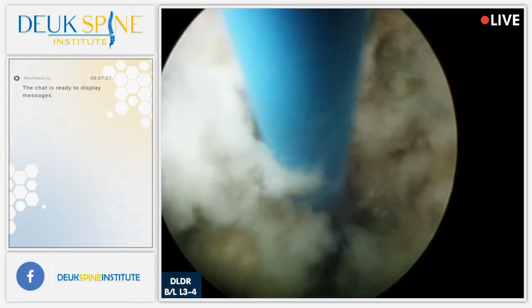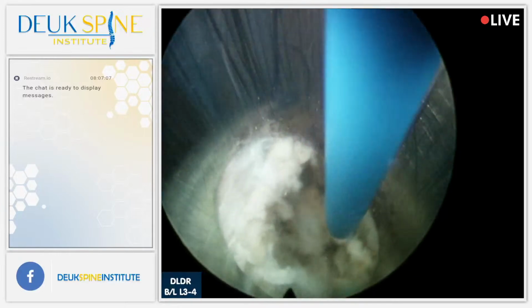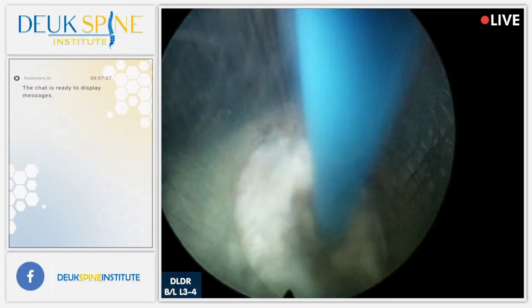Yeah, it's fine. Irrigation's good. Right?